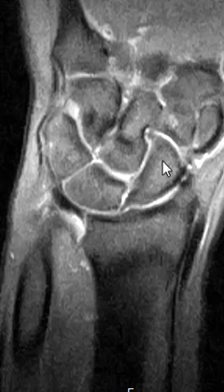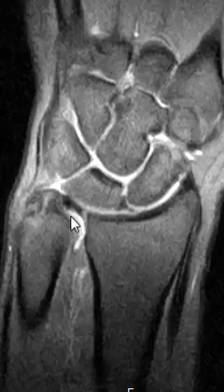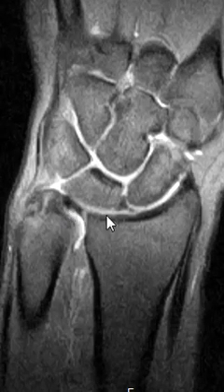Hello, this is Dr. Gay. This is a patient who has a tear of their triangular fibrocartilage. The triangular fibrocartilage is called the TFCC for short, and it's a little horizontal band of cartilage here in the wrist.